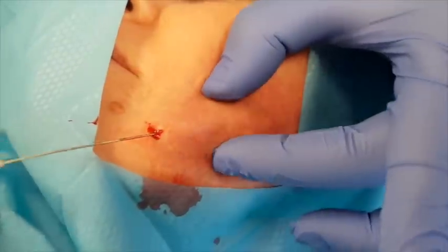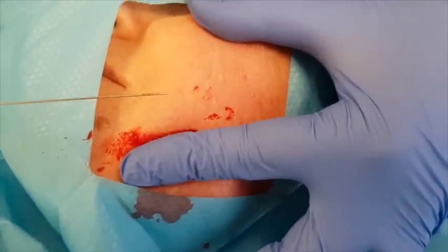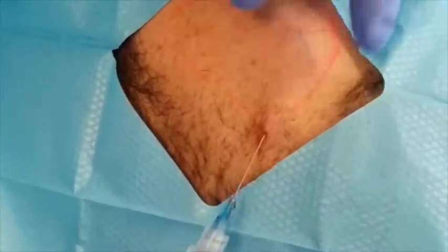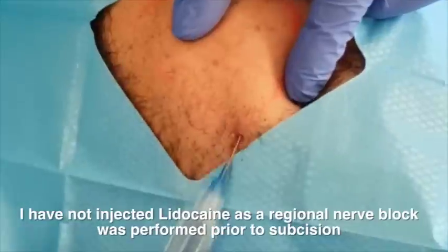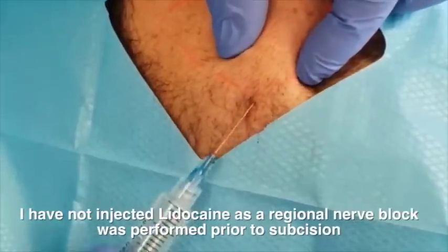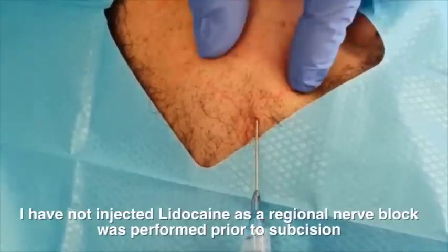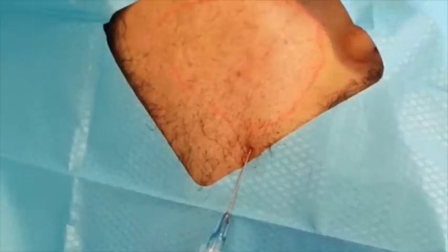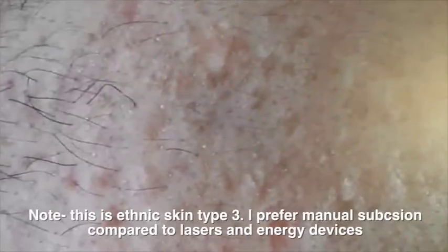You can see just breaking down the scars — I find this a much safer technique because it's a blunt cannula compared to using the no-core. You can see where all the dermal grafts have been performed before and I'm breaking it down. Most of these patients are ethnic skin types with a type of scarring which is usually worse. However, in my opinion they do extremely well with manual scar revision techniques such as subcision, because I am breaking down the bonds. I prefer manual subcision compared to lasers and energy devices for ethnic skin type 3.